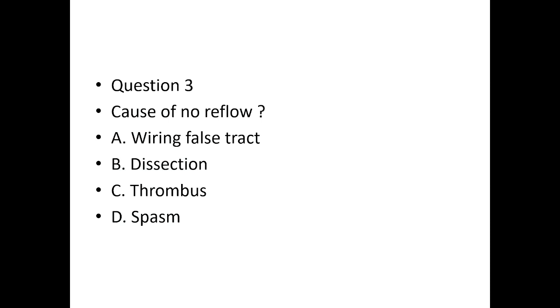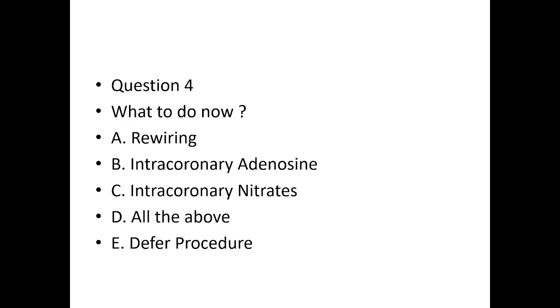Most likely thrombus. So first of all you have given GTN, nitrate, and adenosine, but it was not corrected. First of all, ballooned, but don't lose your wire. Keep the wire in. The wire is inside, not rewiring.